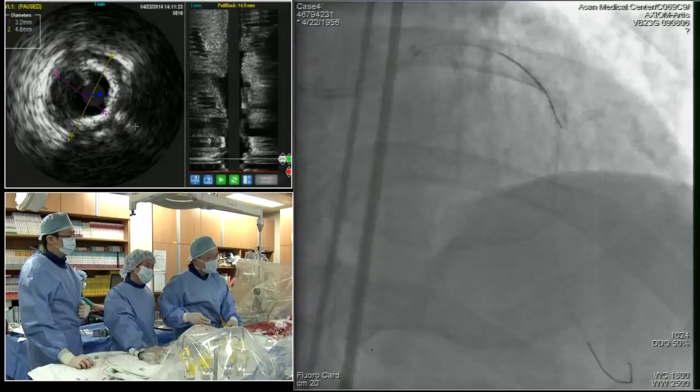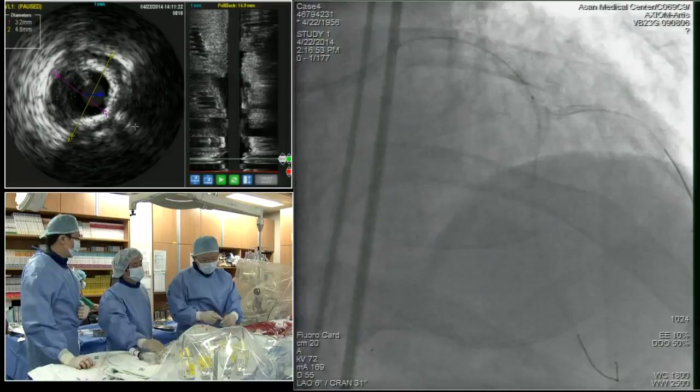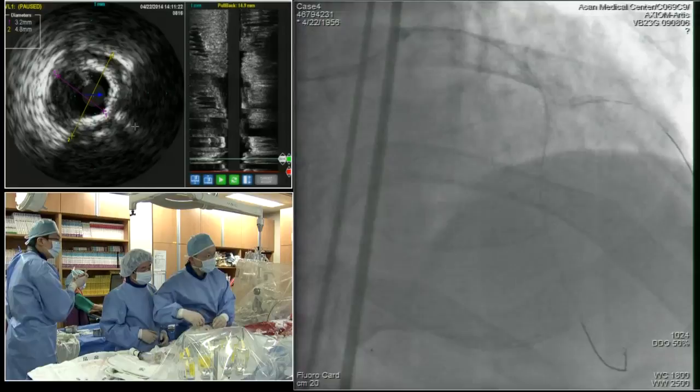You're just going to quit it and leave it. Yeah. Crusade is good, huh? Okay, 2.5 balloon for trapping. Yeah. This is Sion, absolutely. 2.5 balloon. And then I try 135 Corsair.